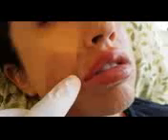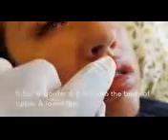Very full. And she has such a full bottom lip. You don't need to put product there. It's just for contouring. So here, now these are done. They're starting to swell up, but you see the vermilion border going all over here, and it's perfect.